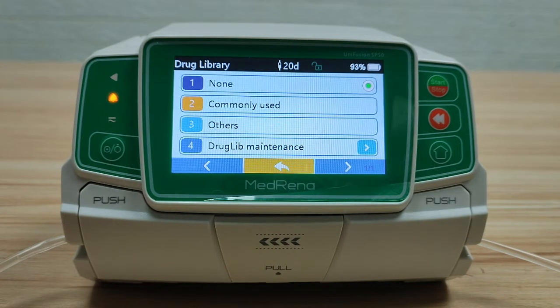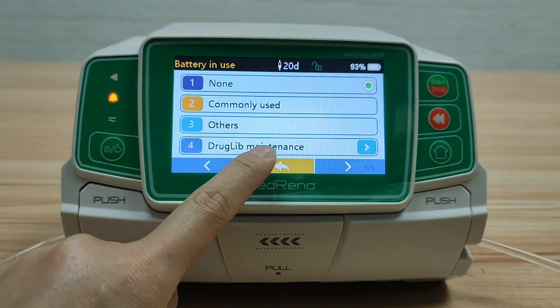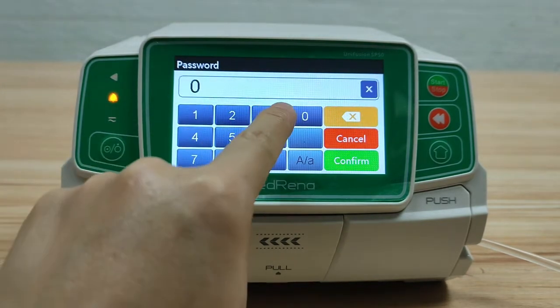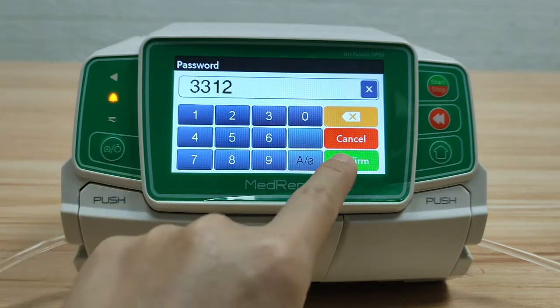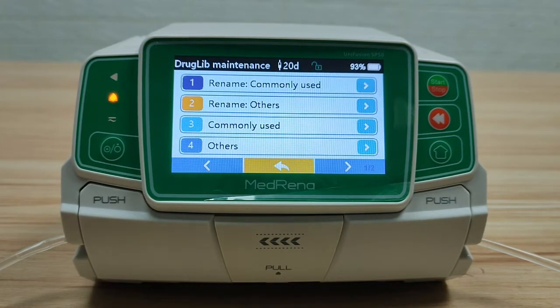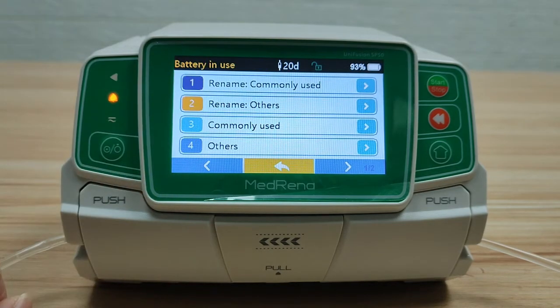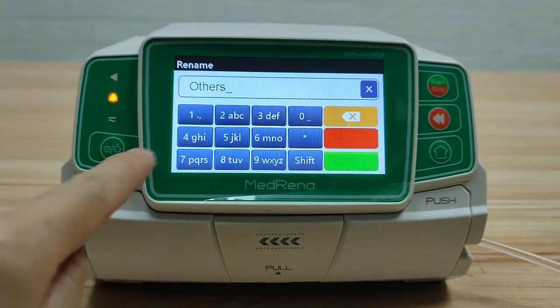First, drug library. The drug information can be found in 'Commonly Used' and 'Others'. To edit the drug library, select Drug Library Maintenance and enter the password 3312. Here we can rename drug groups — for example, to rename 'Others' as 'ICU'.